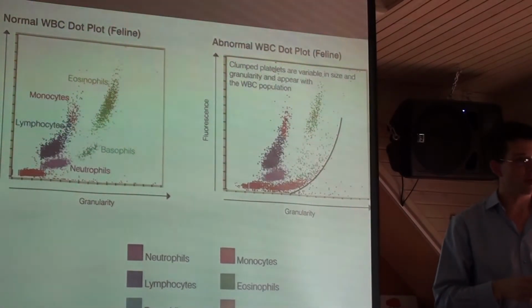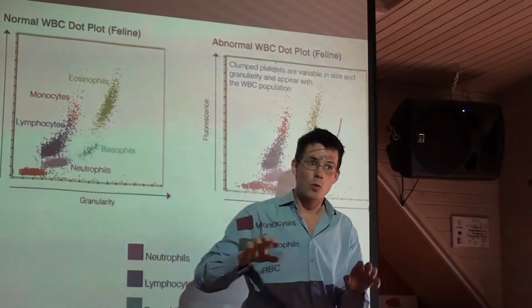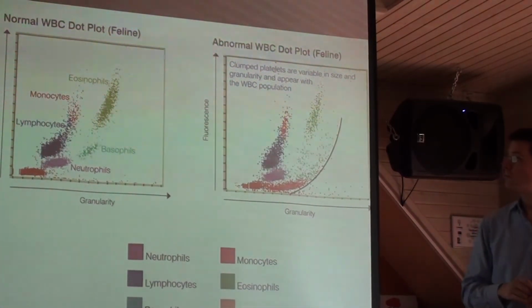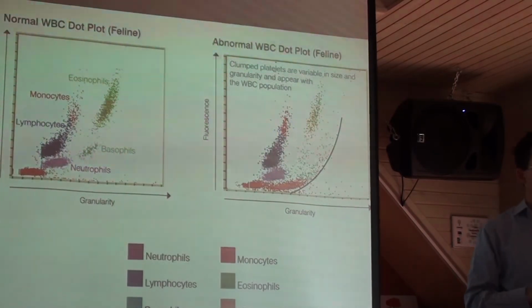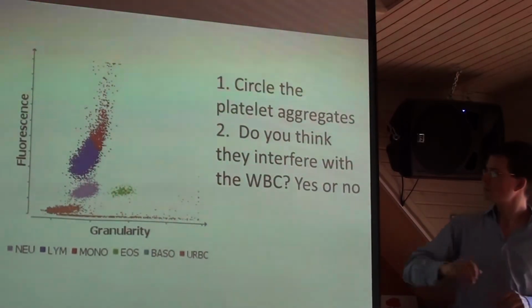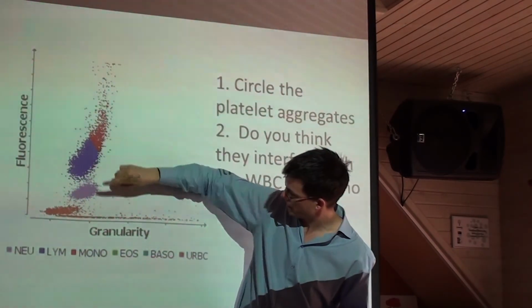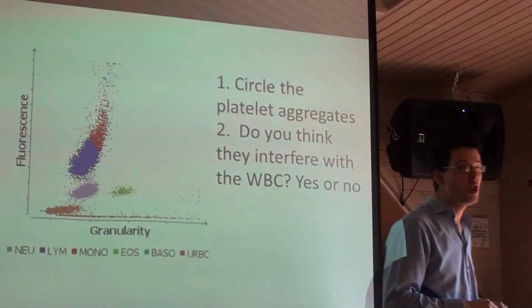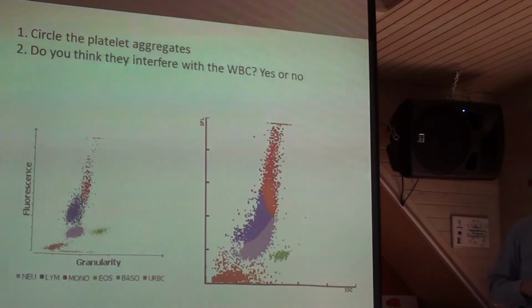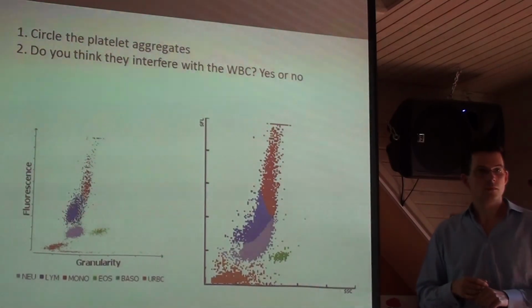However, sometimes with pathology, those clouds of white blood cells will move and come to lie on top of each other. Mõningate patoloogiate puhul siis need erinevad rakkurühmituste kujutised muudavad oma asukohti ja võivad ka üksteise pilvekesi osaliselt katta. So in this example, the blue cells, which we can see are lymphocytes, and the red cells, which are monocytes, are not completely separated. Sellel kujutusel siis sinised kujutatud lümfotsüüdid ja punased kujutatud monotsüüdid ei ole täiesti eraldatud üksteisest.